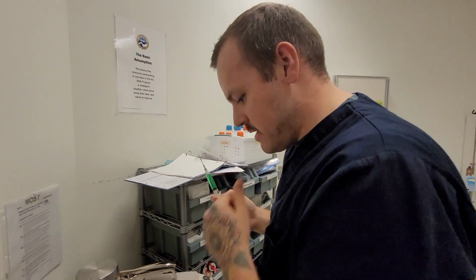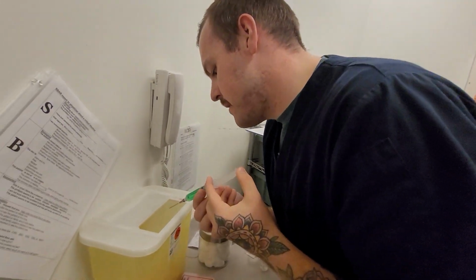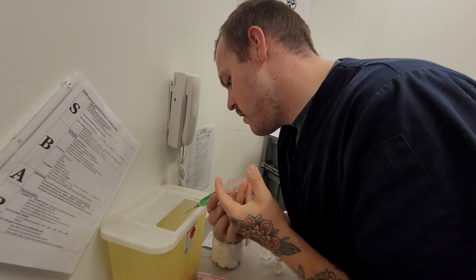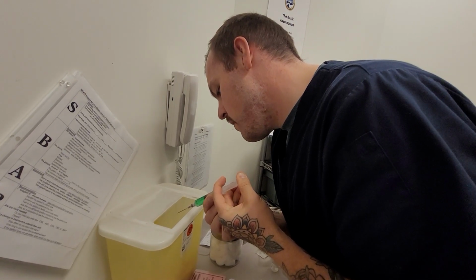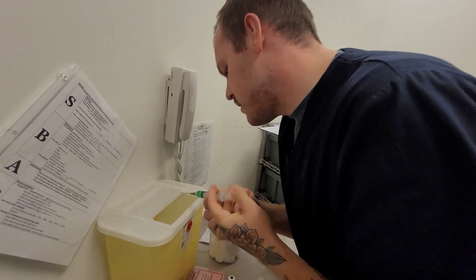Okay, we've got a total syringe volume of 10. We're going to waste down to 2.5. So that's wasting 7.5. Okay, we've got it down to 2.5 there.